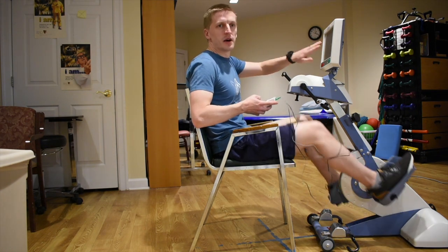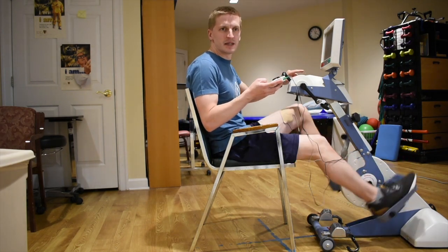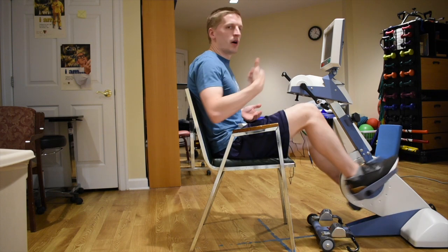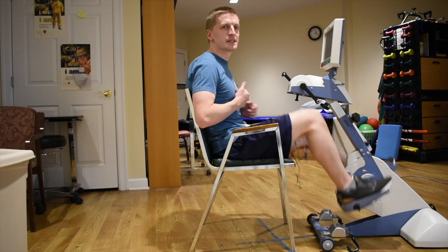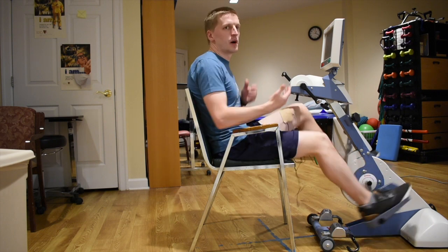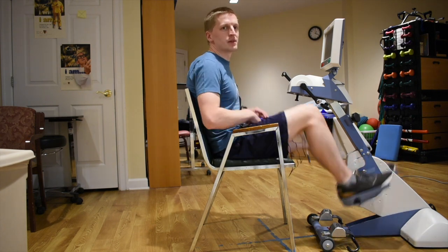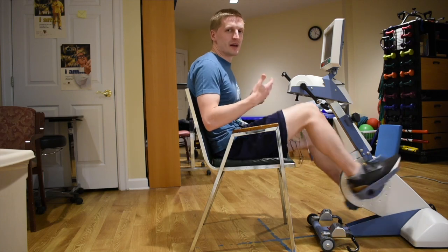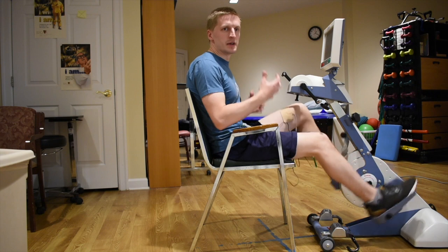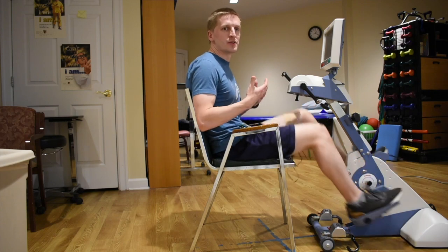Both systems have timers, so do your best to start them at the same time so they finish close together. You'll feel the stimulation through your legs and push through the revolutions at the set frequency — just like walking, left leg right leg, same with the cycle. This will improve your cadence and frequency of revolutions, and that carries over to your steps per minute when you're up and standing and walking with the PENS stimulation.